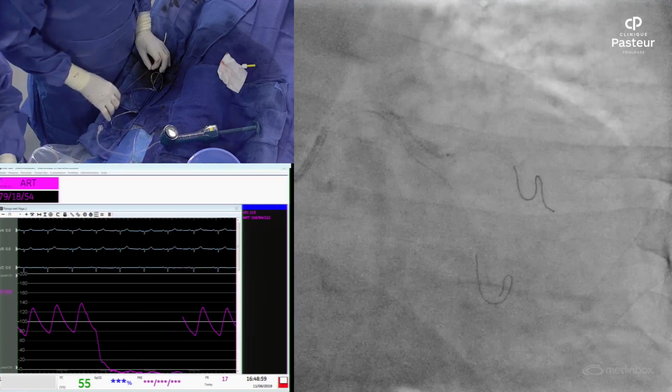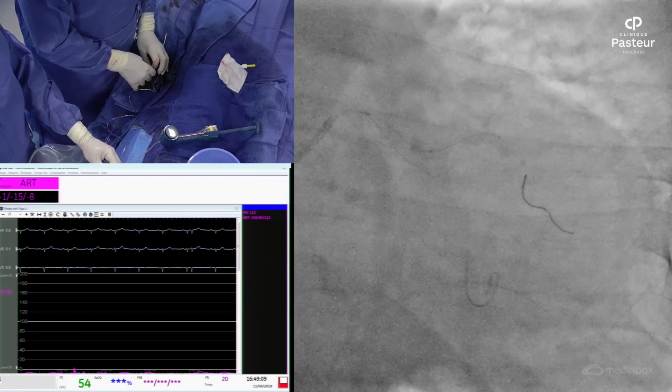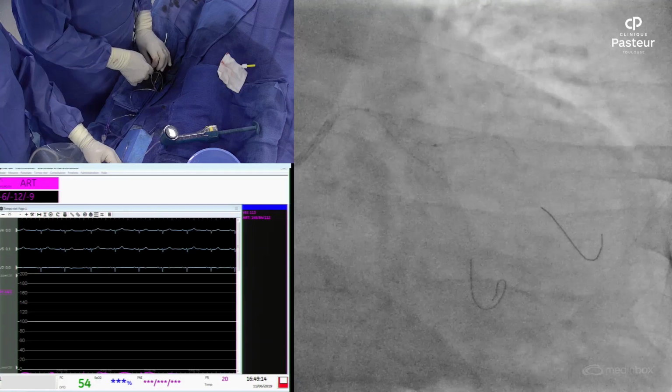We can see the tortuosity on the distal tip of the wire, I think. See? So it was accordion, yeah. We'll see at the end. Okay, I guess we have to be optimistic all the time. Yeah, we can bet on accordion effect, I hope.